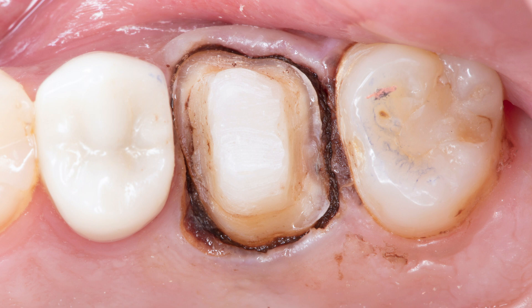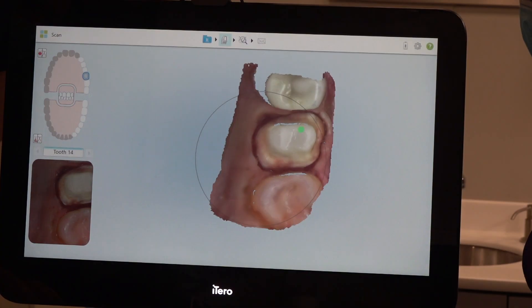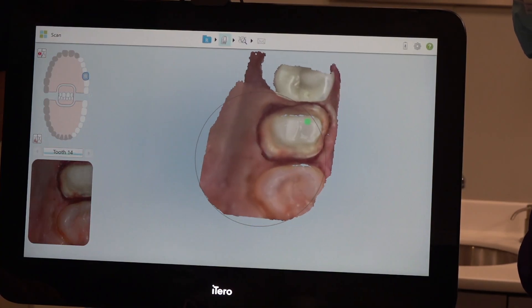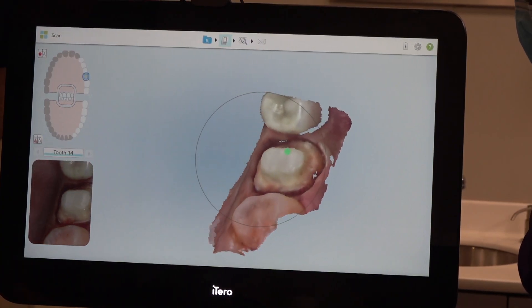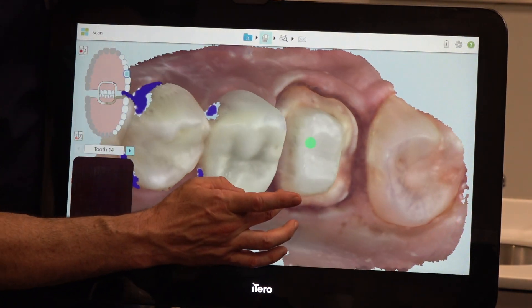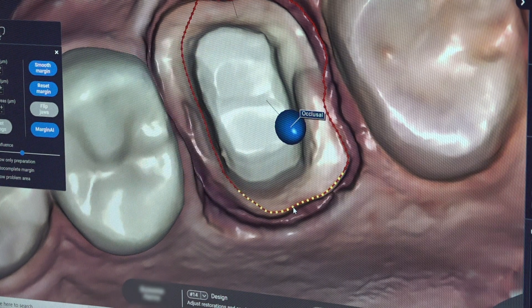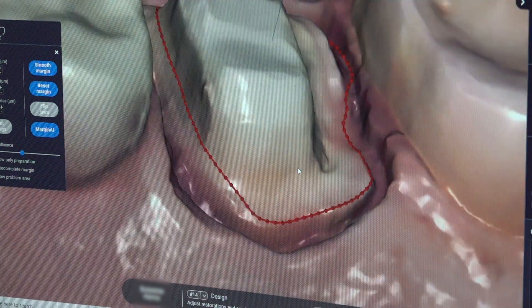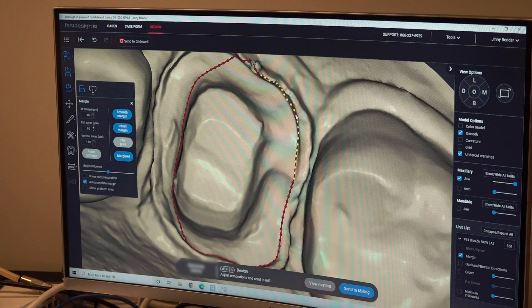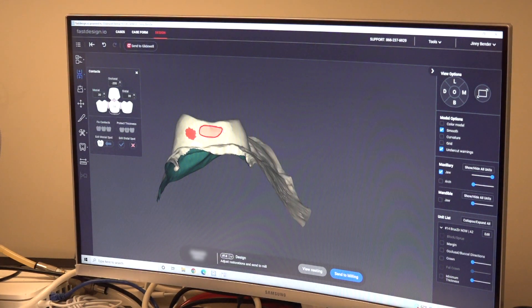The iTero Element 2 is used to scan a digital impression that allows me to recheck my preparation, margins, and occlusal reduction in real-time 3D high definition. The digital information is then transferred quickly to our FAST design software, which uses artificial intelligence to help seamlessly identify and mark the margin, as well as design an accurate crown proposal from Glidewell's vast library database.